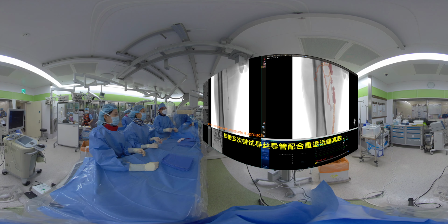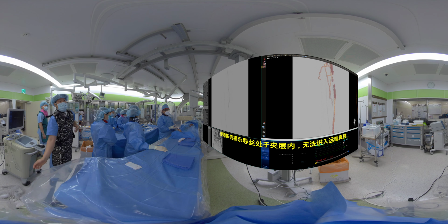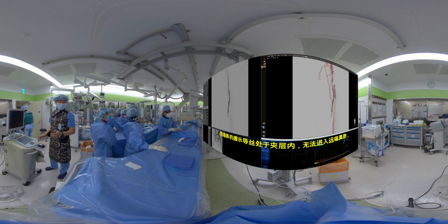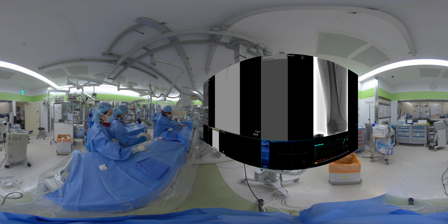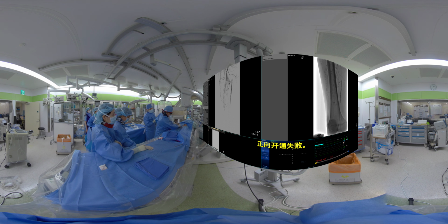Even after multiple attempts of catheter and wire to enter the distal SFA, angiogram still showed dissections without distal runoff, which means re-entry failure.